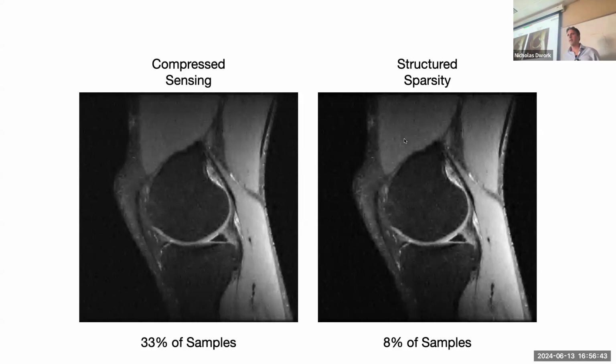I was under the impression that many of the commercial compressed sensing methods also throw in a little bit of TV. Yeah, that is sort of just a wavelet plus a little TV. I've seen that for dynamic reconstruction. When I've seen TV used, I see wavelet sparsity in the spatial dimensions, and then TV in the temporal.